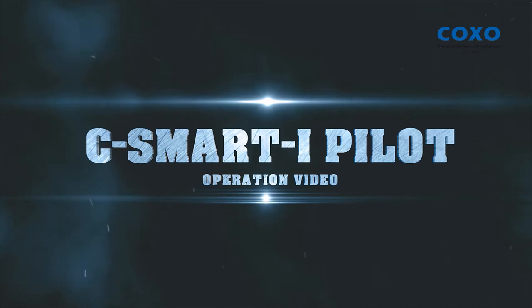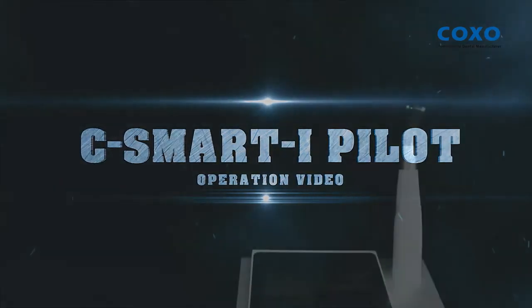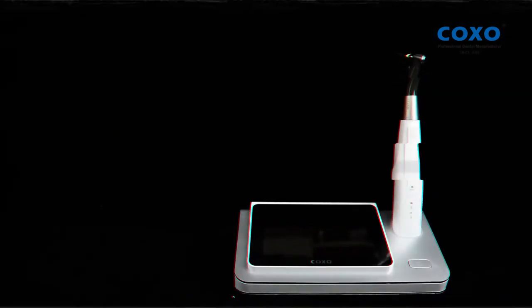C-Smart-I Pilot Operation Video. Endo Motor Mode.